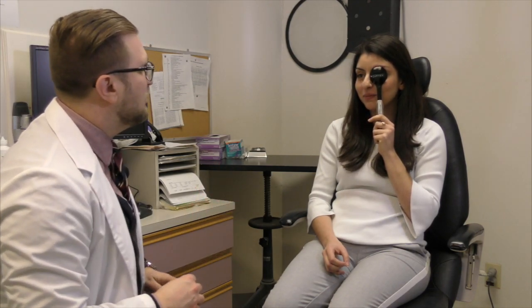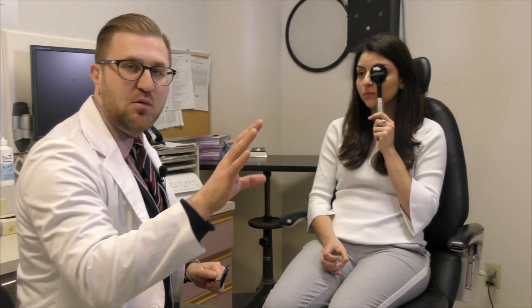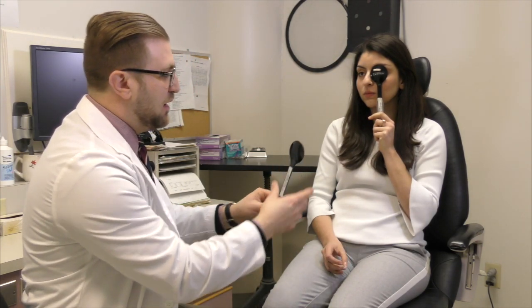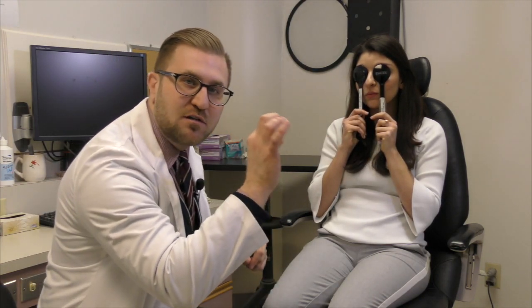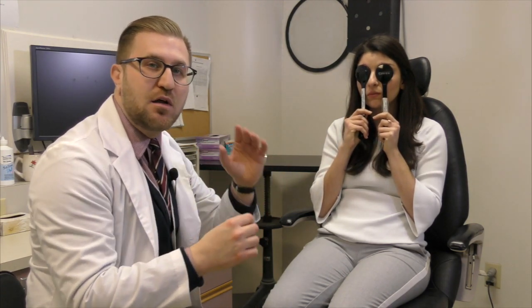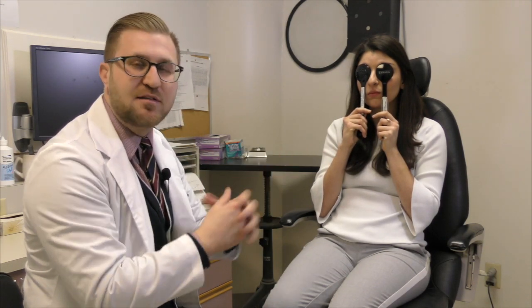Can you see the screen in front of you? Perfect. You're going to have her read the line of letters. Once she reads the line, you can also check with the pinhole — she takes the same hand, holds the pinhole occluder against her eye, and looks through the small holes. The pinhole should correct for any refractive errors, so she should be able to see better through it. Now I'm going to go through a scenario of checking visual acuity in the proper exam setting.